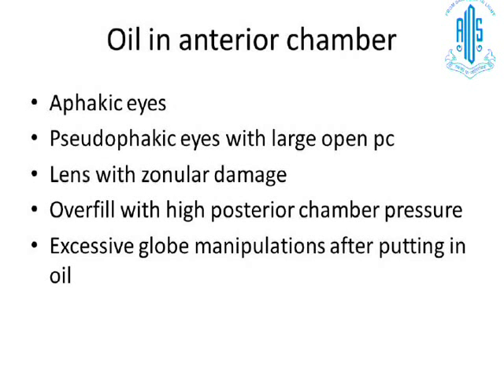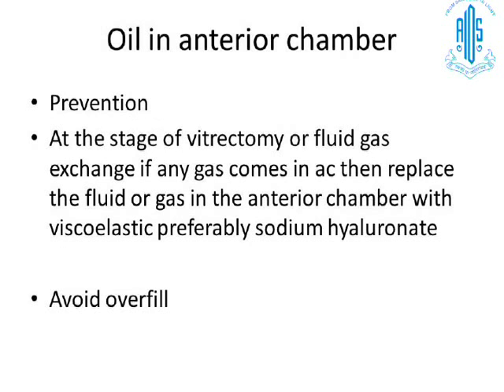This can happen in patients who are aphakic, pseudophakic eyes with a large open PC lens, the normal crystalline lens with zonular damage, overfill with a high posterior chamber pressure, or excessive globe manipulation after putting in the oil. And one must avoid all this once the oil is inside the eye. The prevention is very important in these patients.